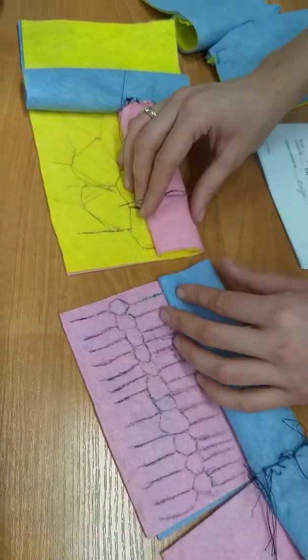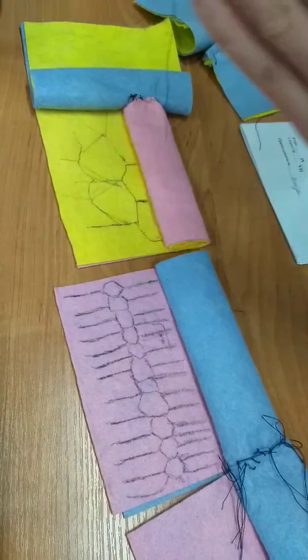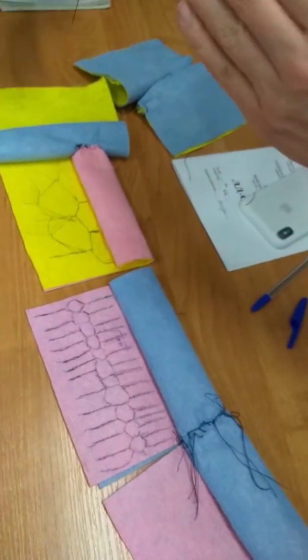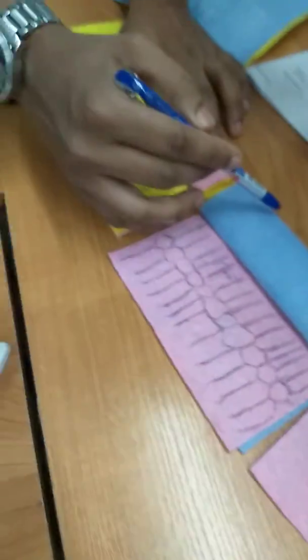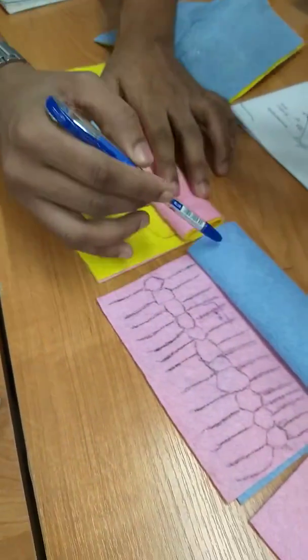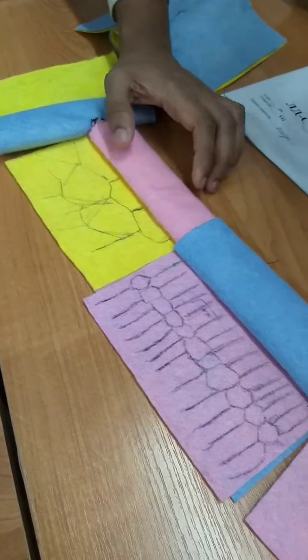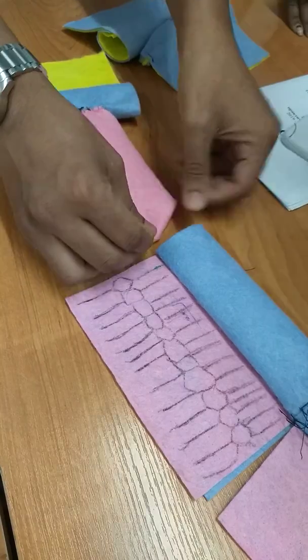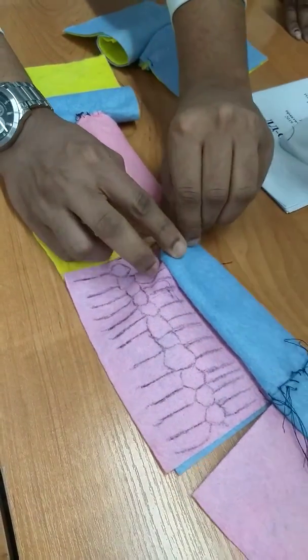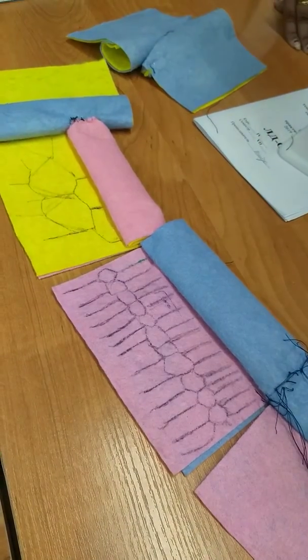So, the anastomosis between them will be a little oblique. This one we cut like this, this also like this, and like this, right? Maybe. So you need to think about it, and remember all the features of the anastomosis. It's quite possible.